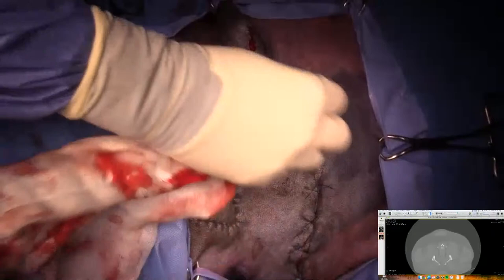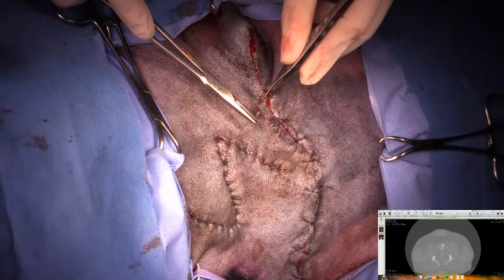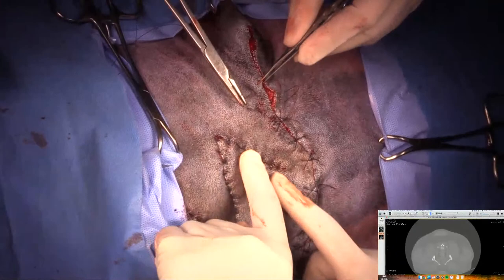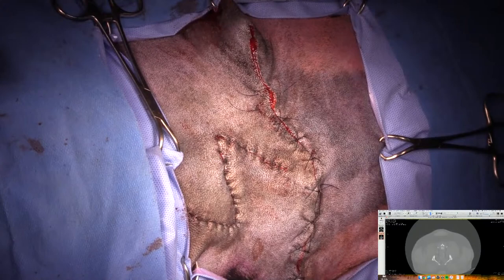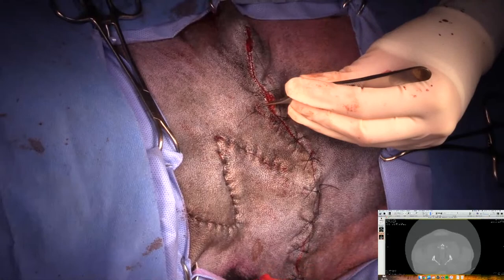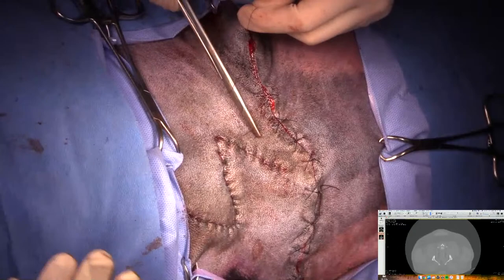All right. So that is pretty much it. We can see that Z-plasty, good demonstration of tension reduction using that procedure. And let's get that syringe again. Lay it on, then. We can see that we've gotten actually about 3 centimeters of extra skin there. So really, really helpful. I love the Z-plasty. I use it all the time. It doesn't require any real planning beforehand other than just making sure that you have prepped and draped enough skin. So I highly recommend that as an option.